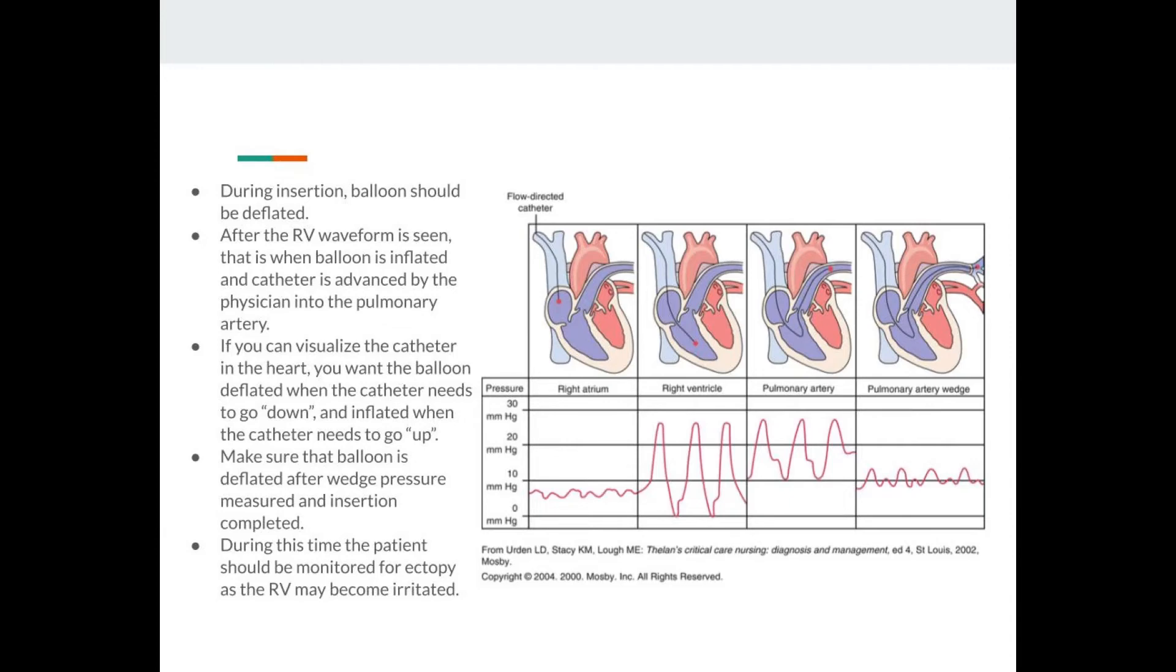So again, you're in the RV. Typically, they'll tell you to inflate the balloon. Always give them confirmation that it is inflated before they proceed. They'll continue to advance it, hopefully into the pulmonary artery.